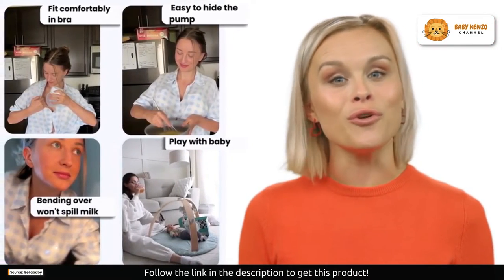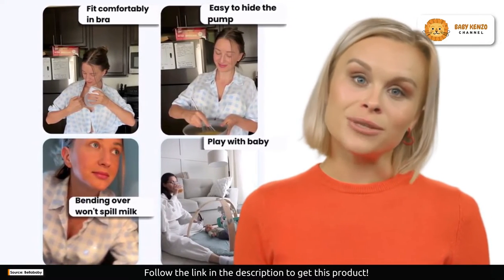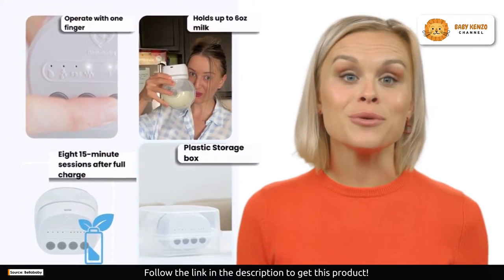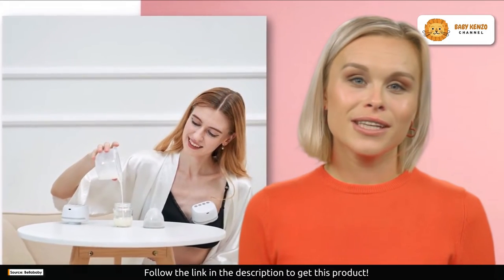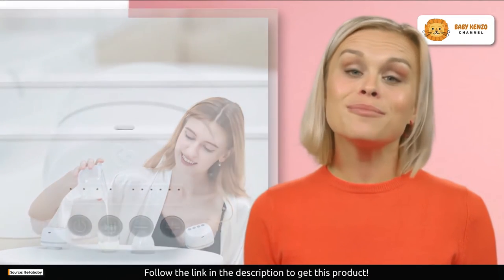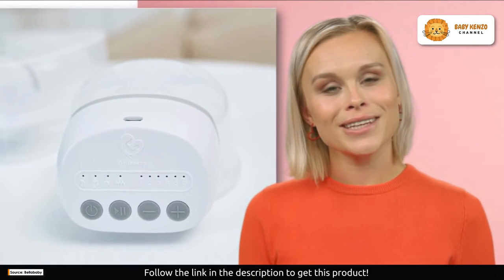The Bellababy W42 is hassle-free and incredibly convenient, perfect for busy moms who need simplicity in their lives. And if you are worried about disturbing your little one's sleep, you can rest easy. Thanks to its quality motor and innovative technology, this pump operates silently. No more late-night disruptions or awkward moments in the office. The Bellababy W42 lets you pump with confidence anytime, anywhere.